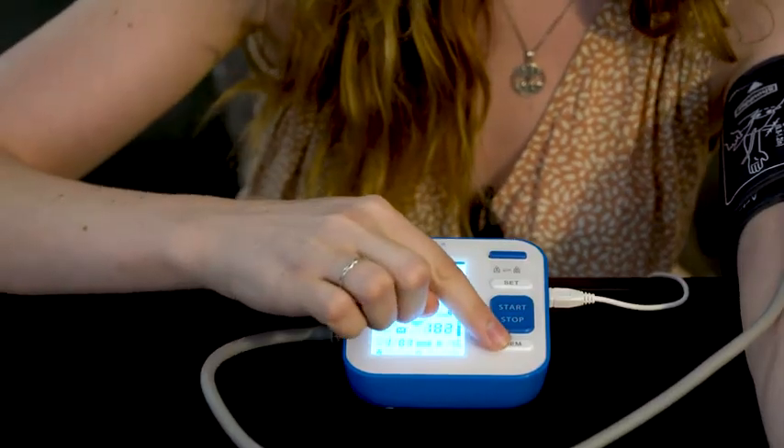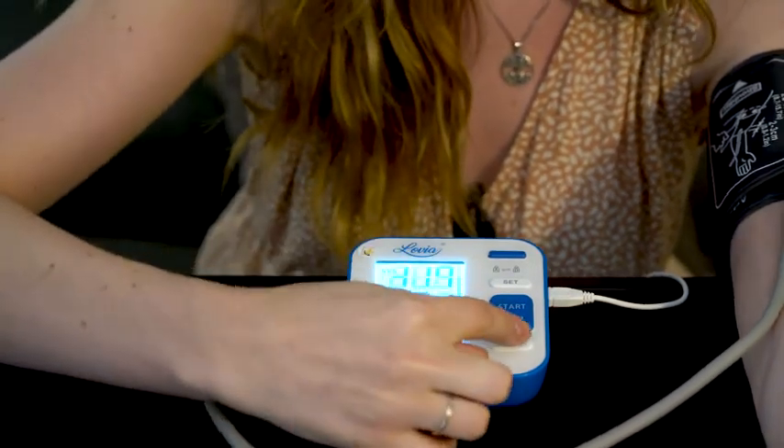When you press this button here you can review the memory from your previous times of using the machine.